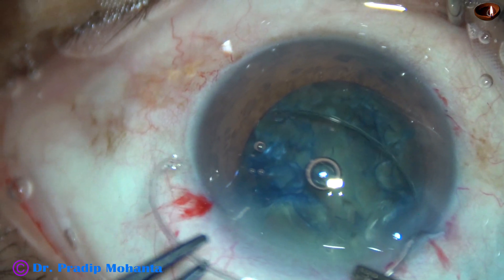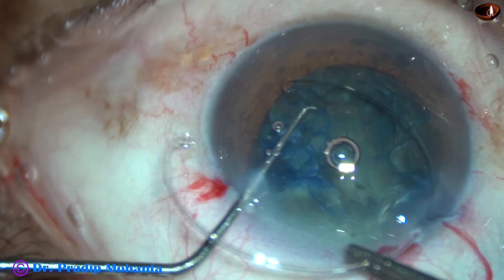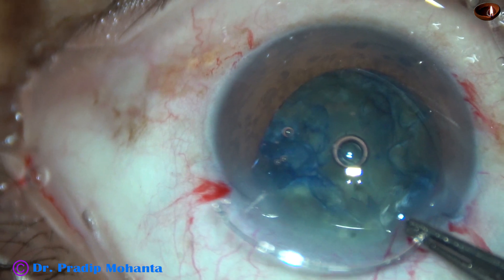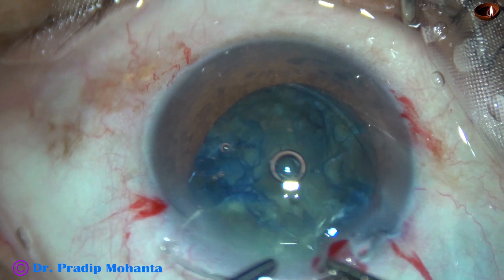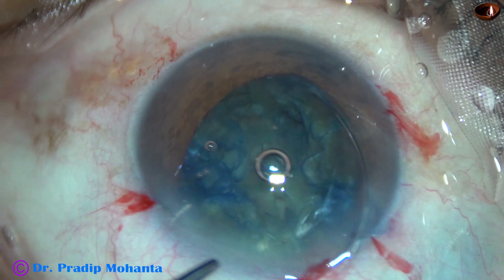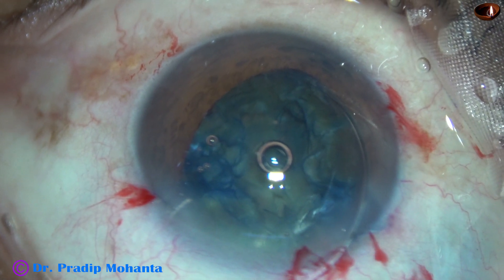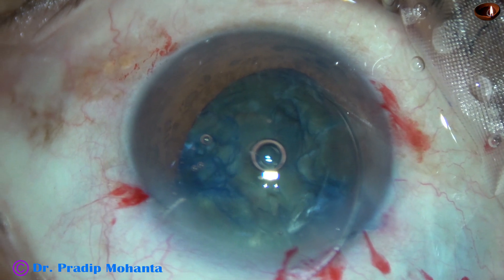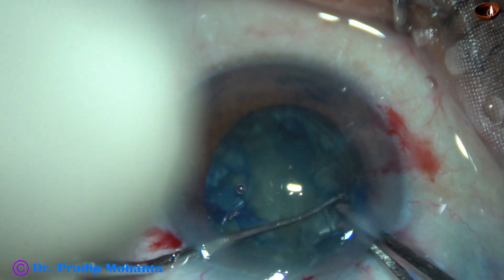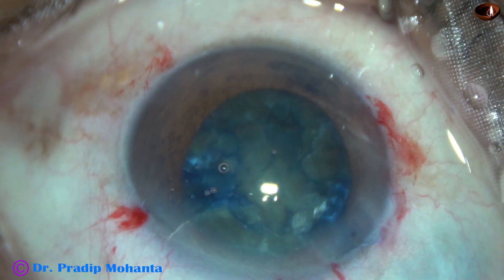The leading end of the capsular tension ring is placed in the capsular bag with the help of a Szynski hook. The Szynski hook helps the leading end to go behind the anterior capsular rim. Now I use two forceps to advance the CTR. And now to place the trailing end of the CTR, I take McPherson's in my right hand and a Szynski hook in my left hand. And here it goes — the trailing end of the CTR goes into the capsular bag.